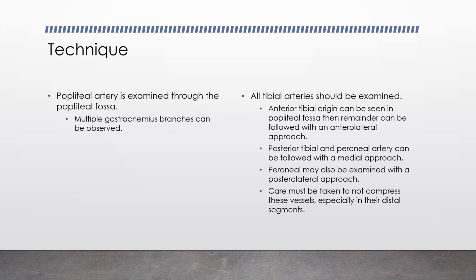Now, these vessels are pretty small, and so these might be ones that you're not getting really great blood flow through. So make sure that you're providing just light pressure so that you're not compressing the vessel, and make sure that you have adequate color gain settings, or go to color power Doppler if necessary.